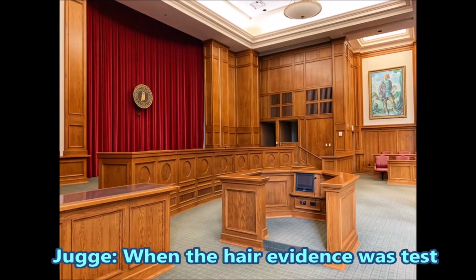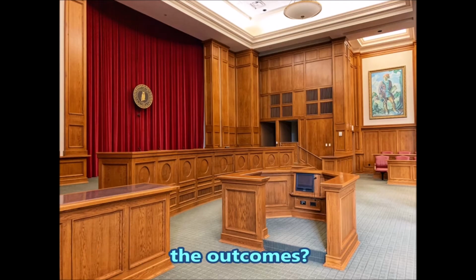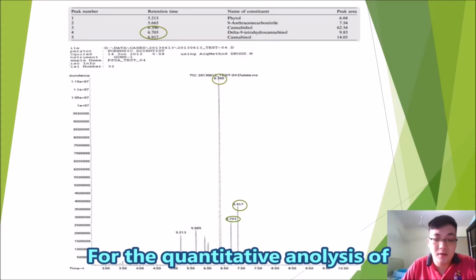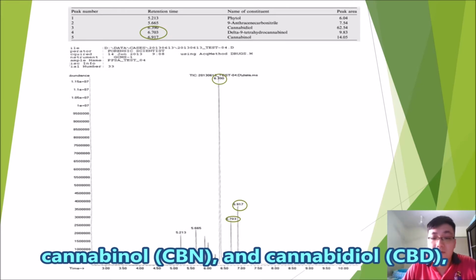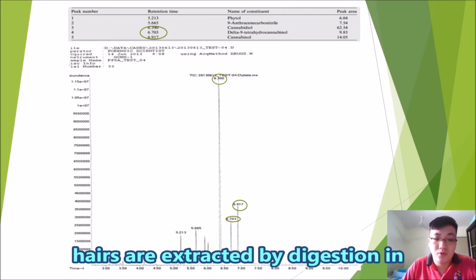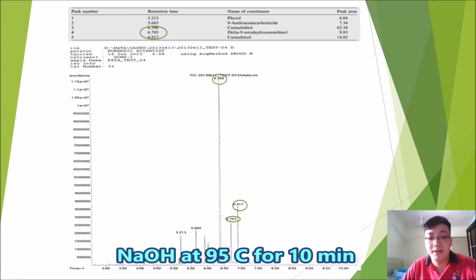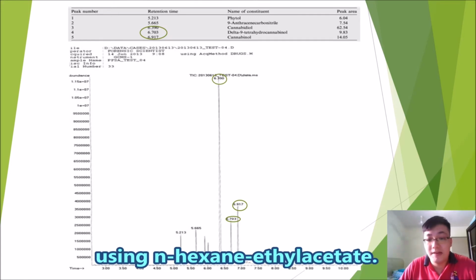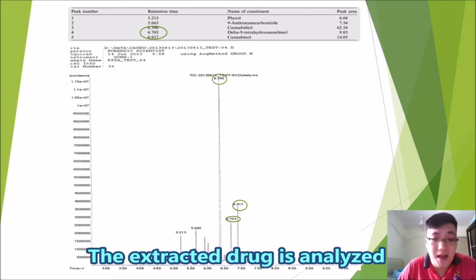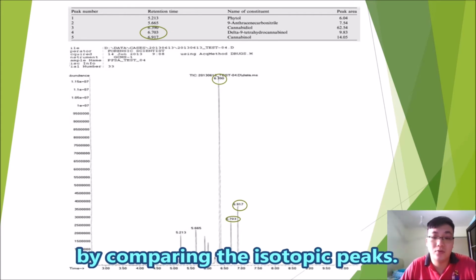When the hair evidence was tested for drug composition, what were the outcomes? For the quantitative analysis of tetrahydrocannabinol, cannabinol, and cannabidiol, hairs are extracted by digestion in 1 molar NaOH at 95 degrees Celsius for 10 minutes, followed by solvent extraction using n-hexane and ethyl acetate. The extracted drug is analyzed on high-resolution GC-MS by comparing the isotopic peaks.